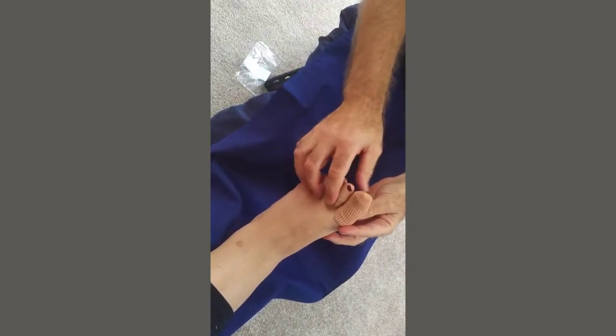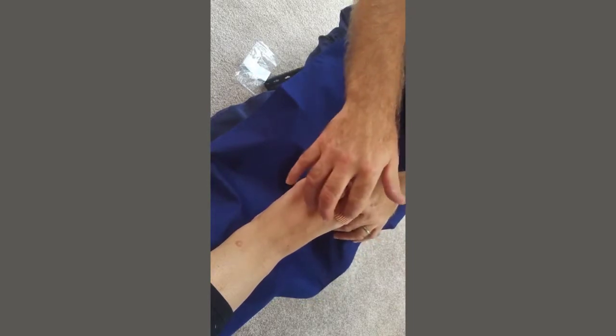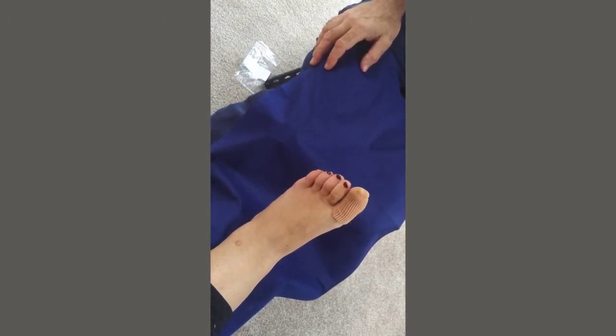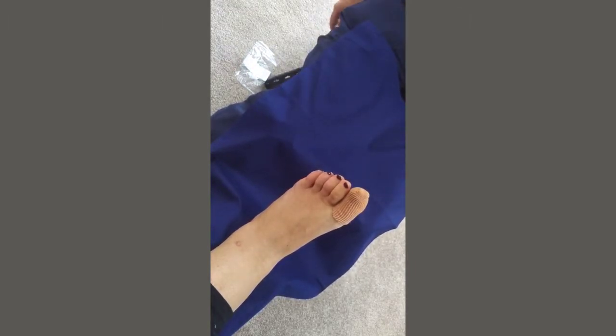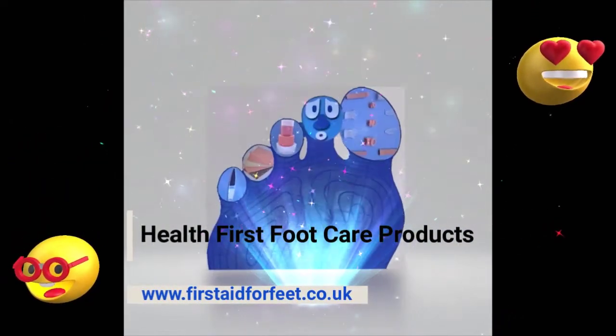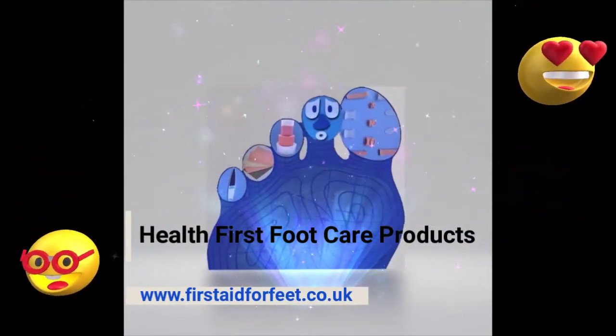So that's the Gel Toe Cap. It protects all around the toe — the top of the toe, underneath the toe, and the end of the toe. It's a very useful product to stop toes from rubbing either against each other or against shoes.